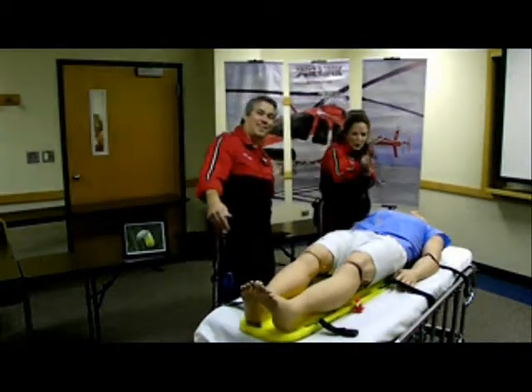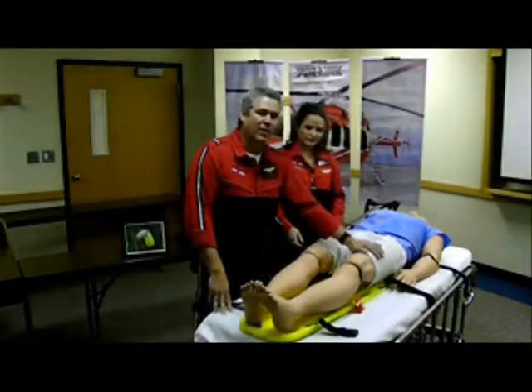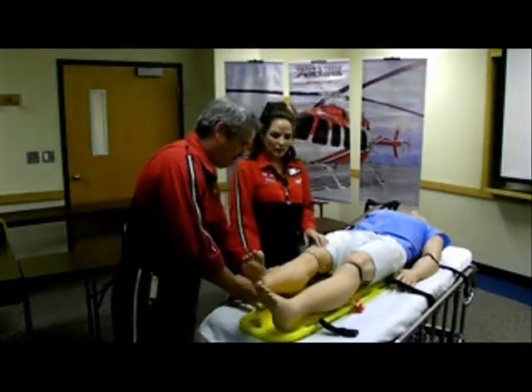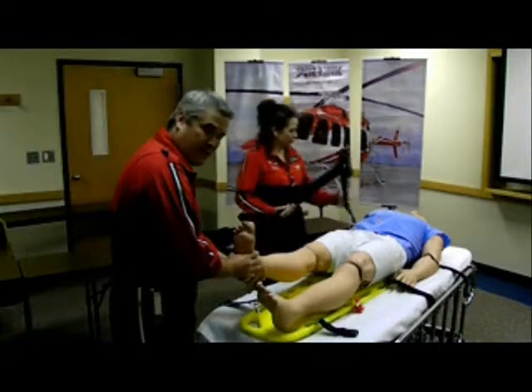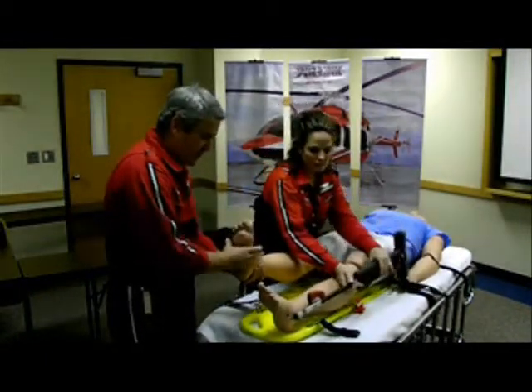Now the indications for the Sager splint are a unilateral or bilateral femur fracture, and only an isolated femur fracture. Initially, you're going to start out by removing your patient's socks and shoes and doing a baseline CMS assessment. We're going to hold inline traction, manual traction, and again, check for pulses, capillary refill, distal sensory.